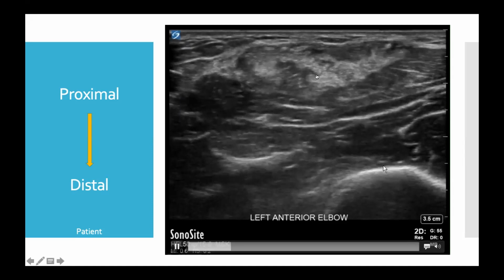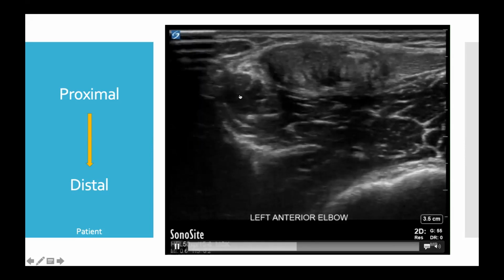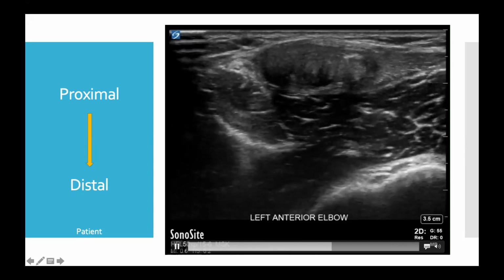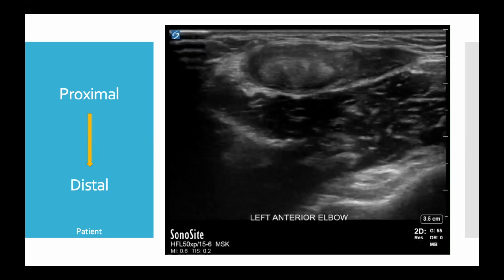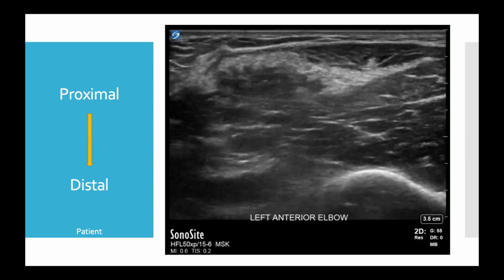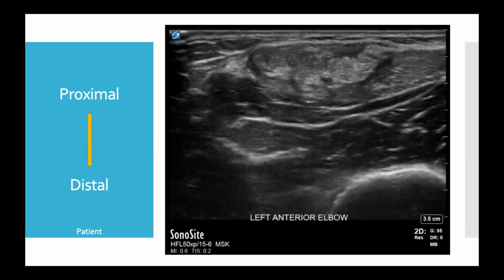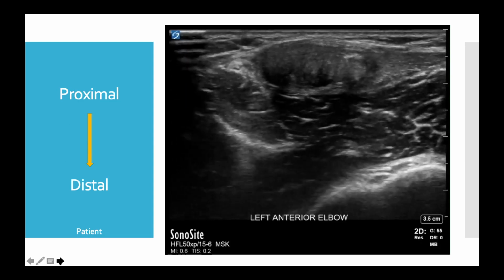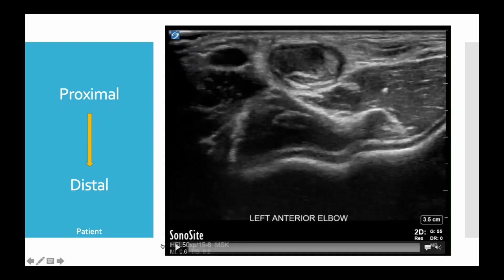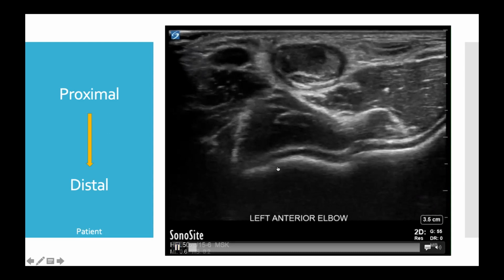We can see that the tendon itself, as we're expecting it to form this tight fibrillar structure and look like a tendon we're used to seeing, is really bulgy, edematous, and significantly larger than what we'd expect. Also, we can see it forming a lot more proximal than when we would anticipate seeing it. This next clip is just further down. We were moving slowly and couldn't get the whole thing, so we took a second video here.